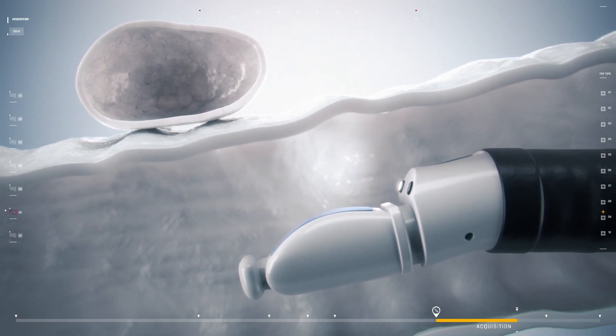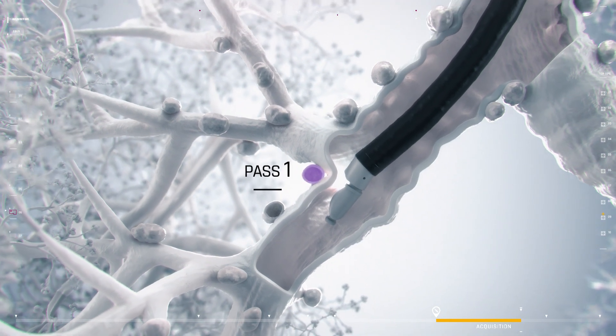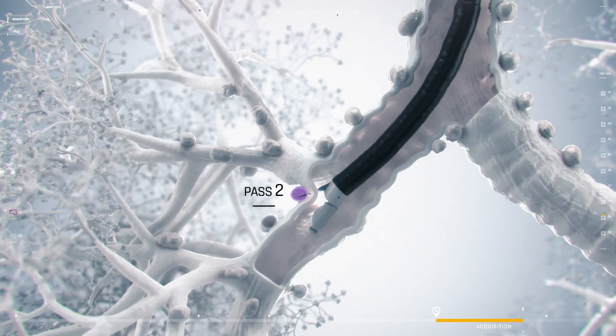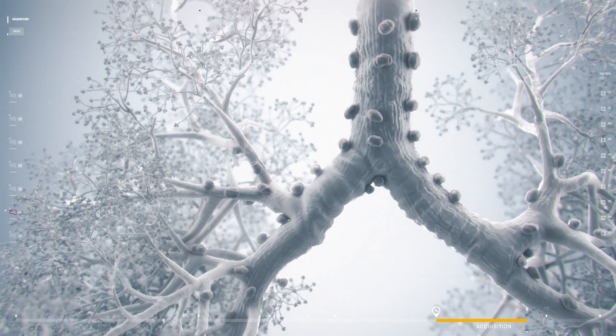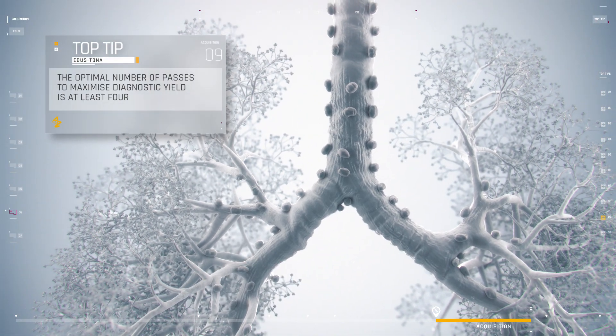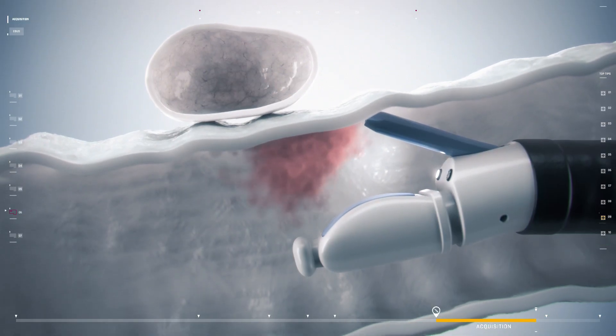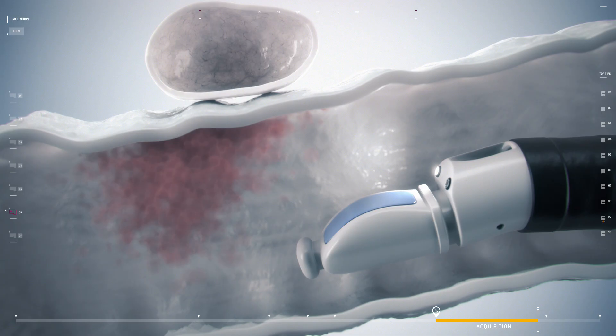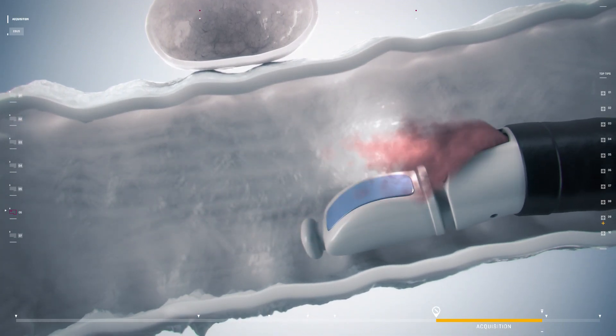The number of needle aspirations per site can impact the yield and can range from three to seven aspirations depending on the study, but the first pass has the highest yield. The optimal number of passes to maximize diagnostic yield is at least four. Immediately after sample acquisition, it can be helpful to move the bronchoscope distal under suction to prevent any blood that was released into the airways from traveling further into the bronchial tree.